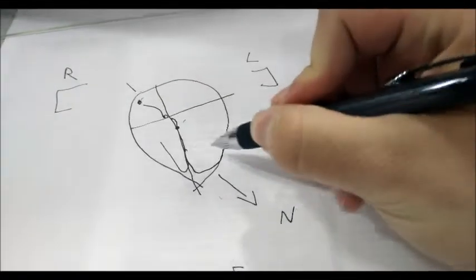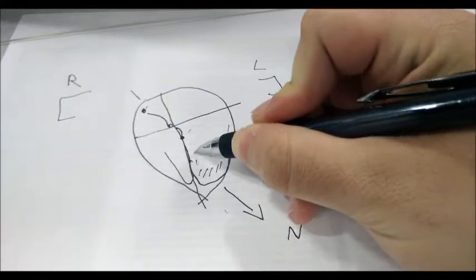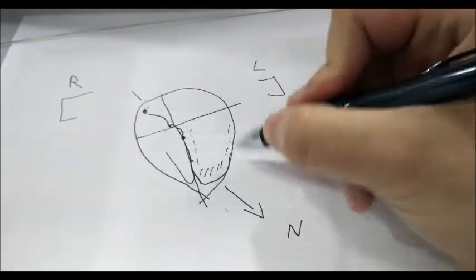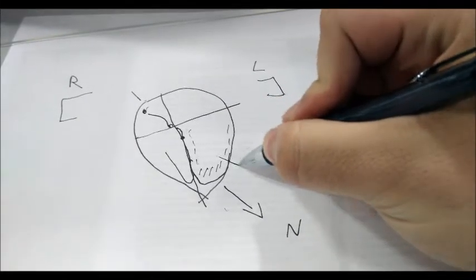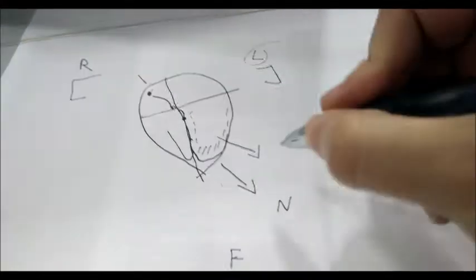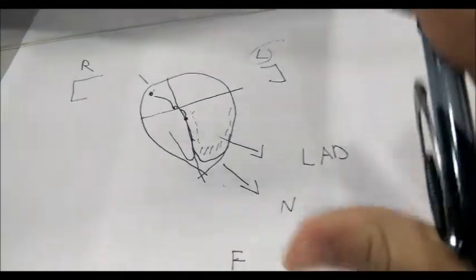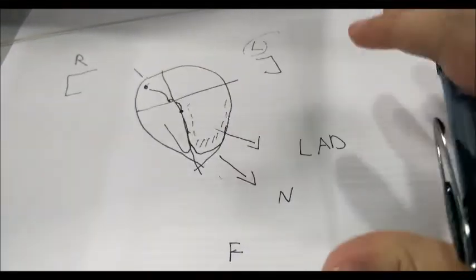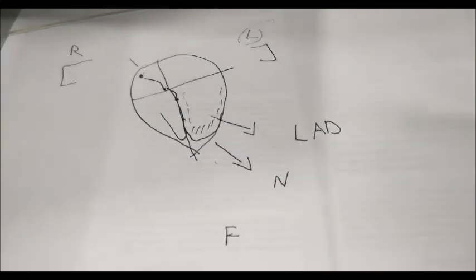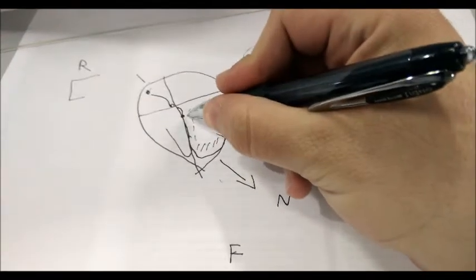Now, what happens if this part of the heart becomes thicker? Well, in this case, you have more electrical conductance in this area of the heart. More electrical conductance means that the axis of deviation is going to shift more towards the left. Remember, this is the left over here. So this is what causes a left axis deviation. And again, remember, an EKG, all it is showing you is electrical activity. I'm going to be talking about how we get left axis deviation, normal axis deviation, right axis deviation in just a minute. Now what if you block the electrical signal here?